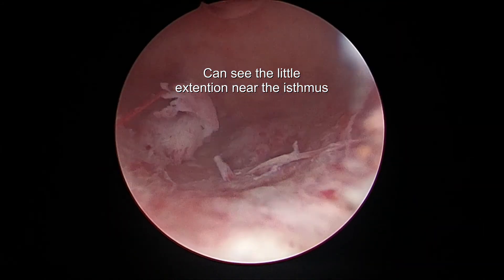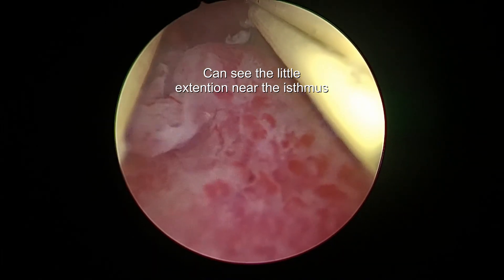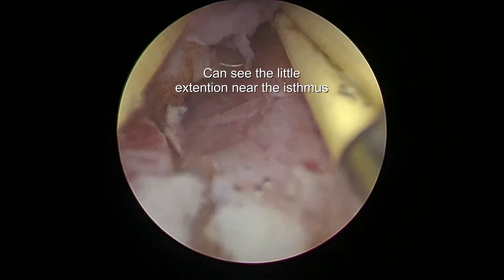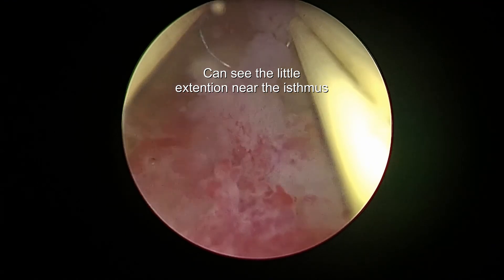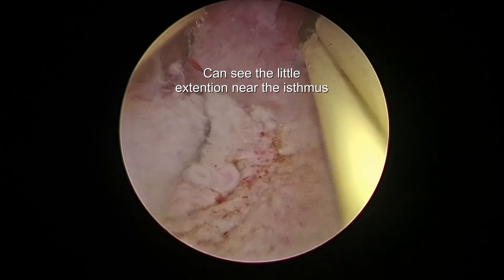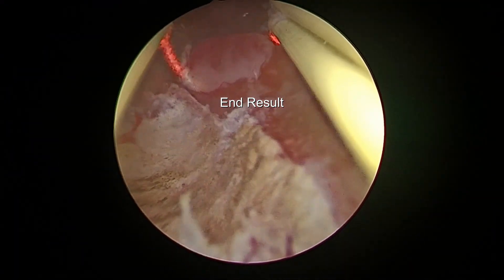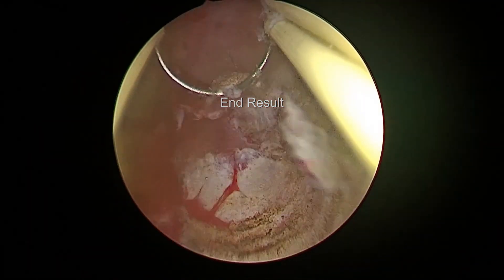There are only a few remnants left near the isthmus on the posterior cervical part. We will just resect superficially like this — can you appreciate this? This is how you do superficial resection of this part. It is the portion of the polyp that was left behind. I am just resecting it out superficially on the posterior cervical part.